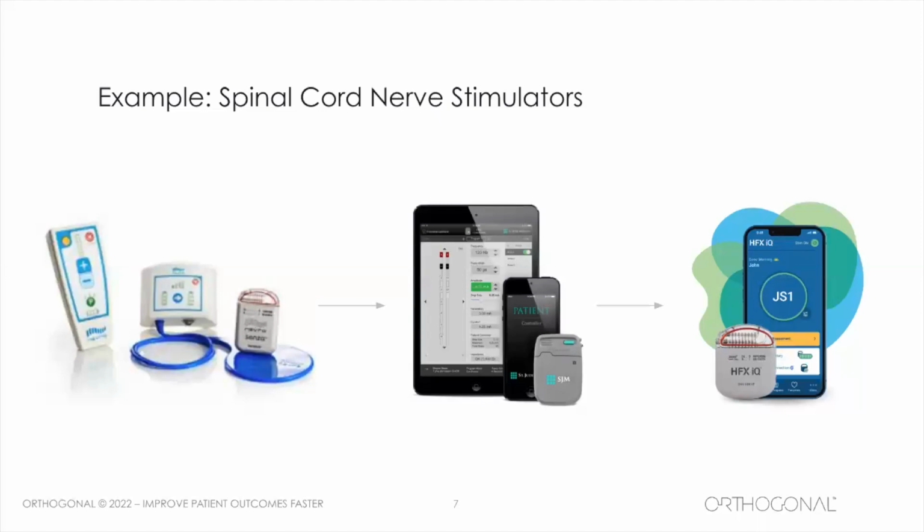And in addition to that, you can actually set your device into MRI safe mode so that you can safely go through an MRI machine with a spinal cord stimulator inside your body, and then also take it back out of MRI safe mode.